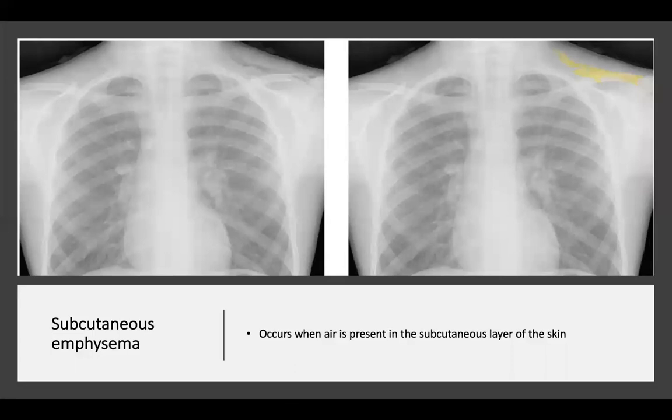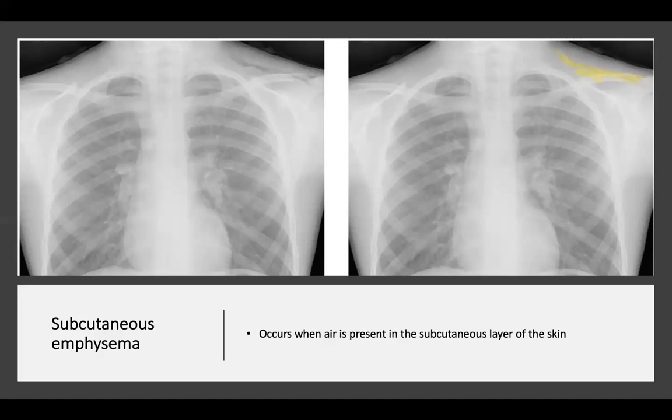That showed an example of subcutaneous emphysema — the abnormal distension of tissues caused by retention of air. Subcutaneous emphysema occurs when air is present in the subcutaneous layer of the skin, appearing as blackness where there should be whiteness on a radiograph. Causes include trauma, pneumothorax or an improperly functioning chest drain, and esophageal rupture. In this case the patient was asthmatic and coughed violently, rupturing a bulla or bleb, allowing air to escape into the mediastinum and track upwards to the left shoulder. The subcutaneous emphysema is marked in yellow on the right radiograph.